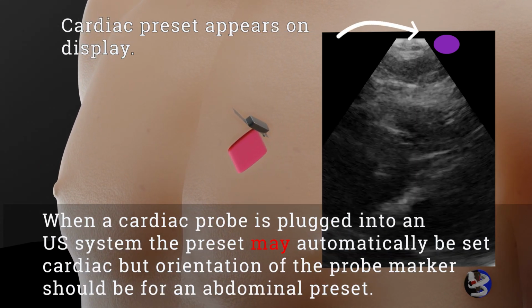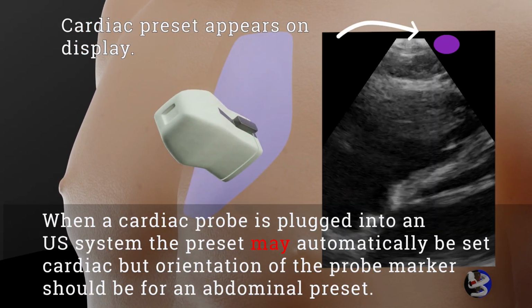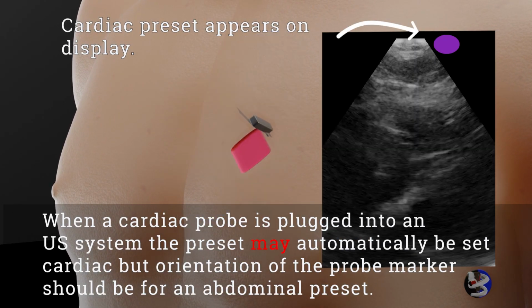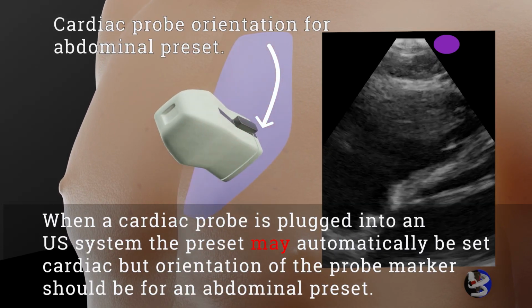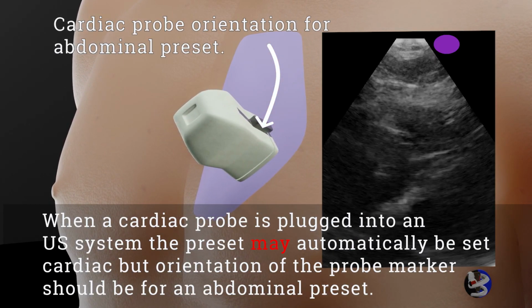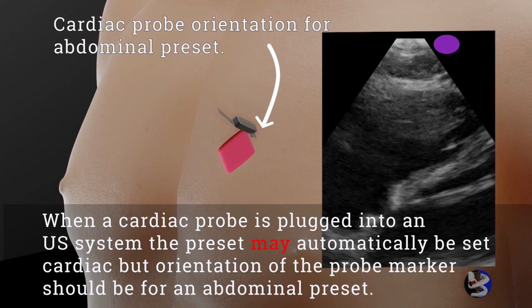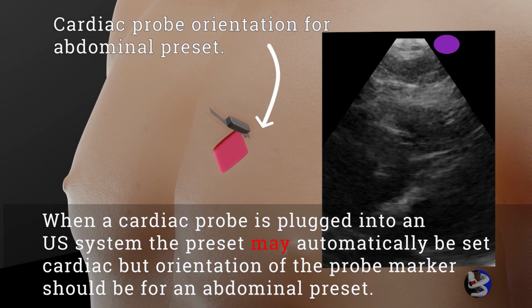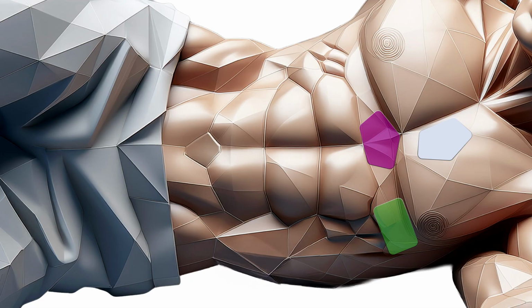In these, the orientation of the probe's notch with regards to the patient's chest should be that described for the abdominal preset. I know this sounds confusing, so it is important to recognize the orientation of the cardiac structures in relation to the location of the probe's indicator. If you notice the structures on the other side of the ultrasound display, you need to rotate your indicator by 180 degrees.